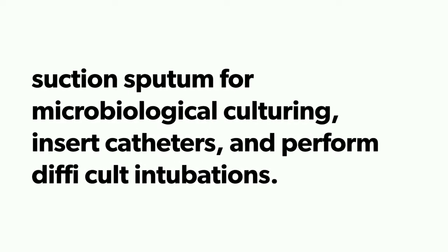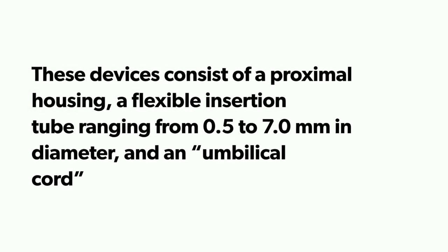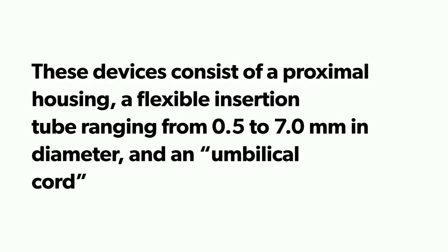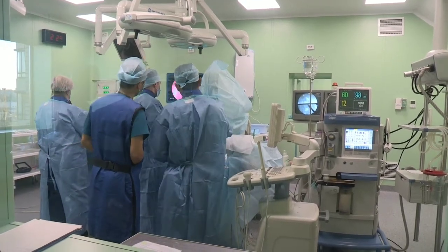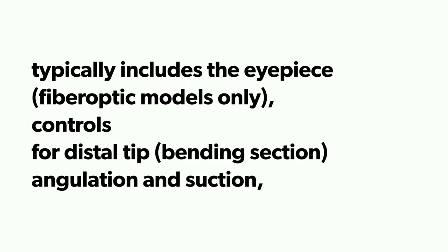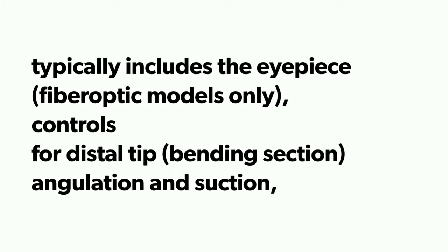The device consists of a proximal housing, a flexible insertion tube which is 0.5 to 7 mm in diameter, and an umbilical cord which connects the light source and the proximal housing. The proximal housing, which is designed to be held in one hand, typically includes an eyepiece, the controls for the distal tip angulation and suction, and the working channel port. So how does this equipment work?